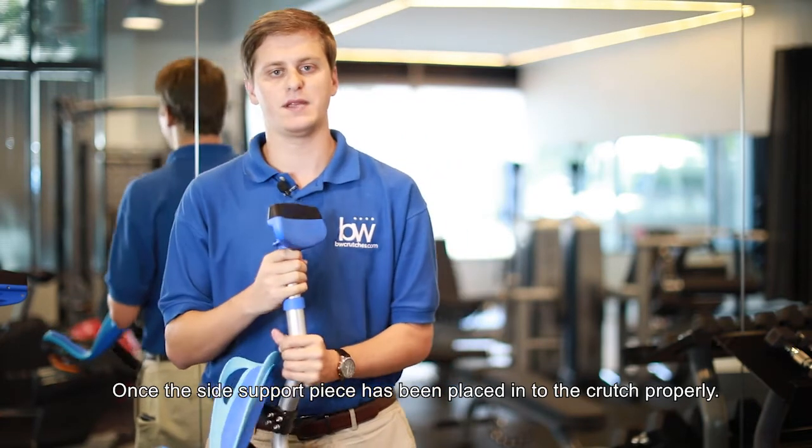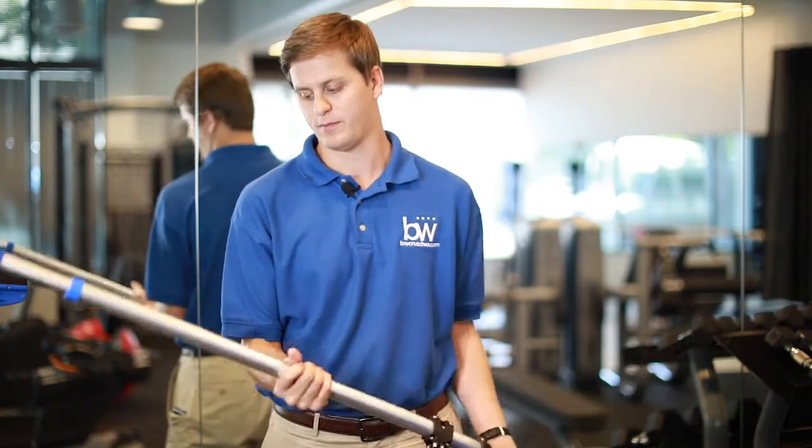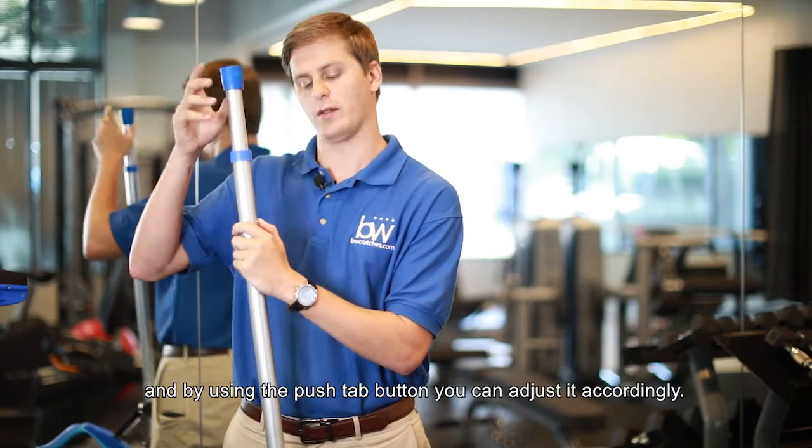Once the side support piece has been placed into the crutch properly, next you want to make sure that you choose your proper height. The height range goes from 5'2 to 6'4, and by using the push-tab button, you can adjust it accordingly, just like this.